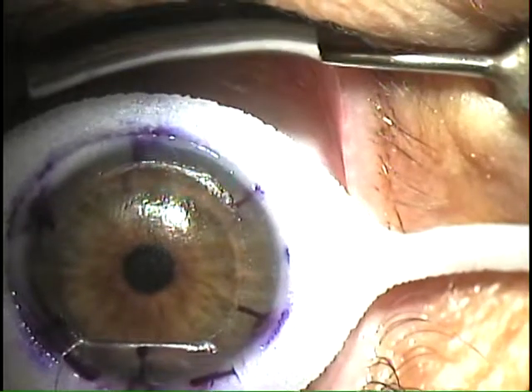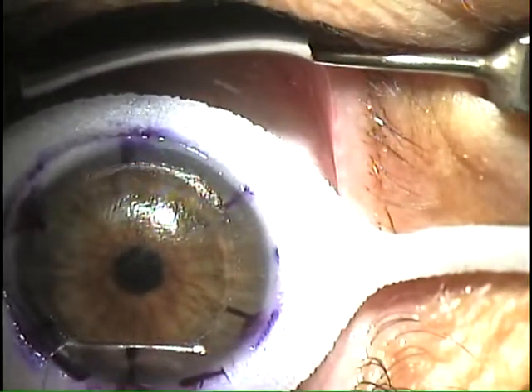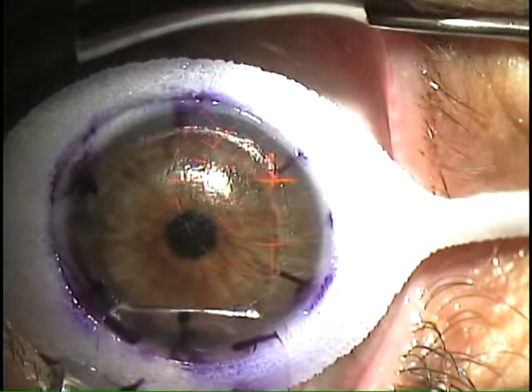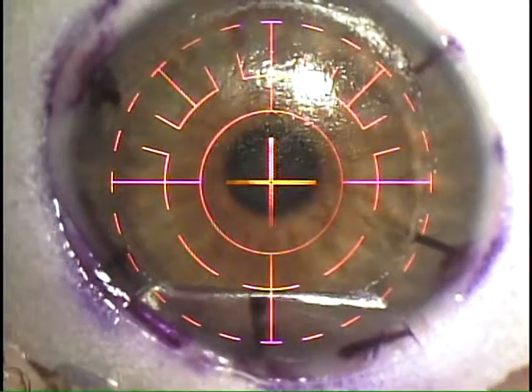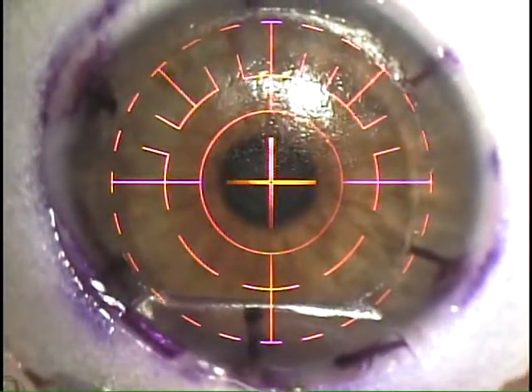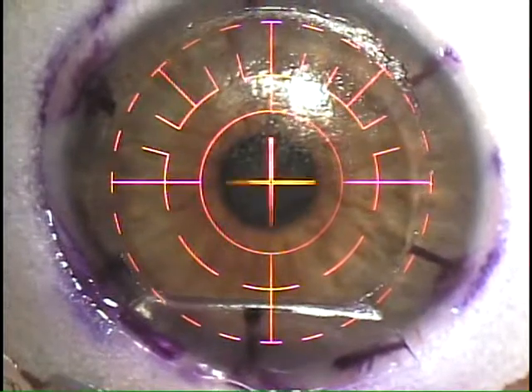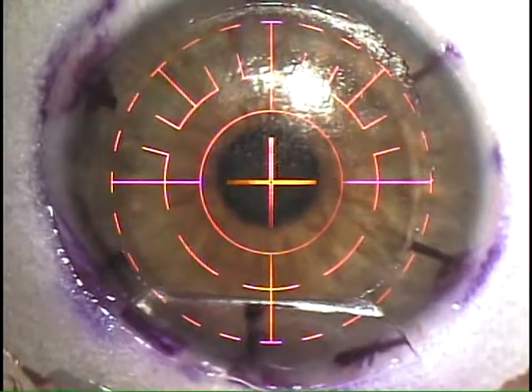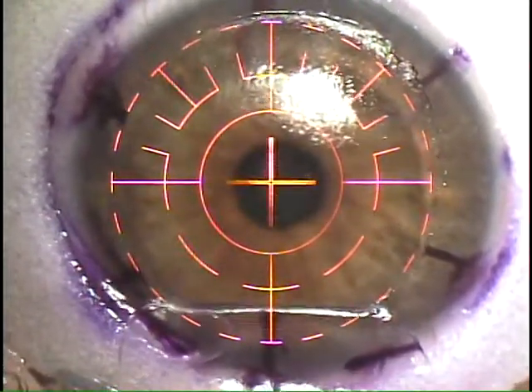It's pretty darn dry here — I think that's going to be an issue for us. Now at this point we're going to put on the reticule so we can center the laser, and we're going to turn the lights down so that Barb can see a lot better. I'm going to zoom in — we're ready, tracking. Okay Barb. Laser's complete.